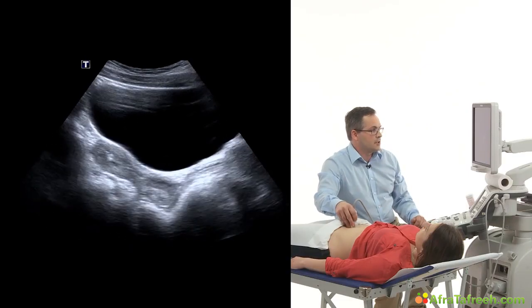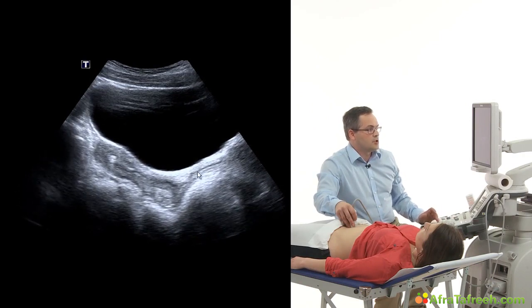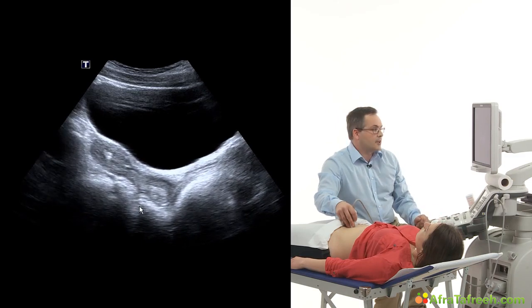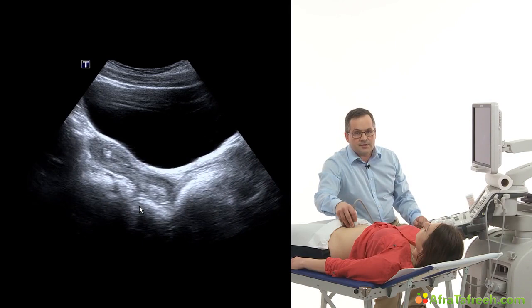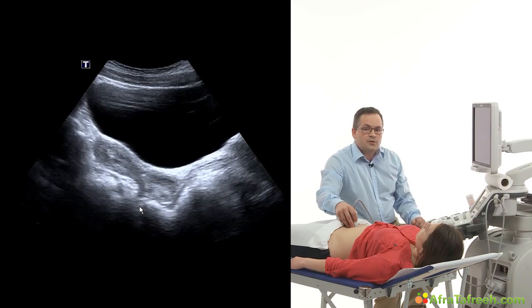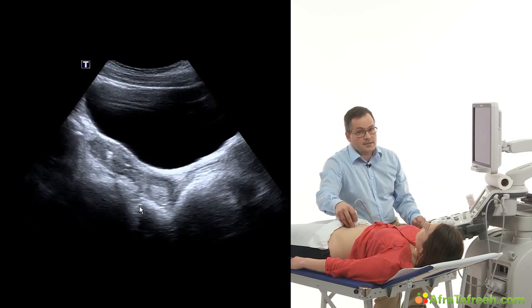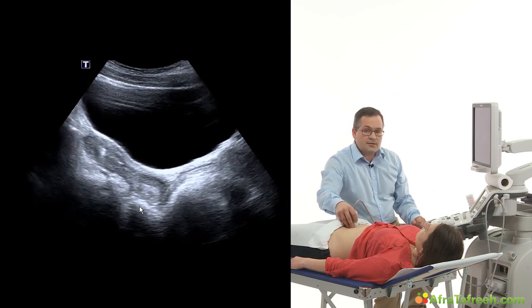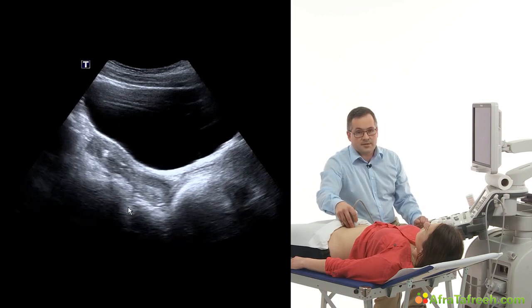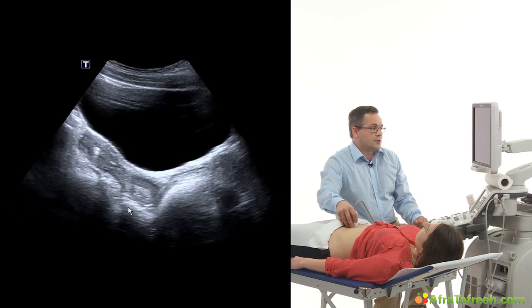So, once again, the echo-free bladder, vagina and uterus. Dorsal to the uterus, we find the space of Douglas, the recessus recto-uterina, which gives place to free fluid if there is abdominal bleeding or ascites. So if you're looking for signs of abdominal bleeding or ascites, this region is of our greatest interest. In this particular case, there's no free fluid seen, so a healthy patient.